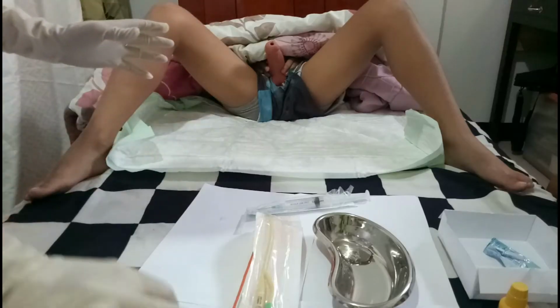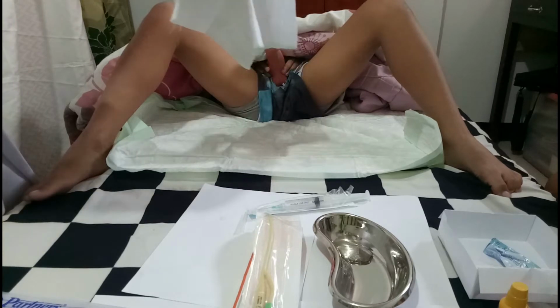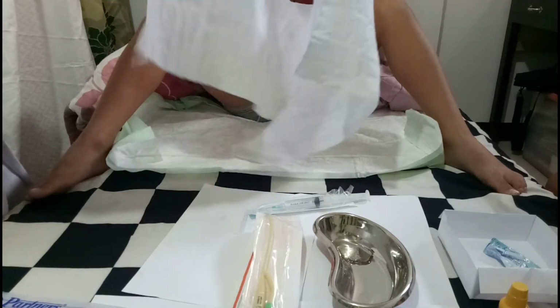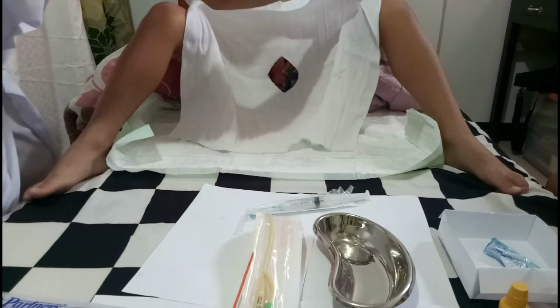Next, I will place the second drape on the patient to provide privacy and sterility to the patient's penis. This is to provide sterility to the patient.